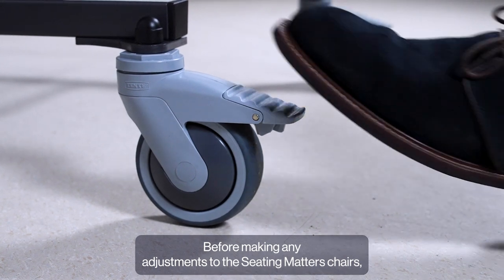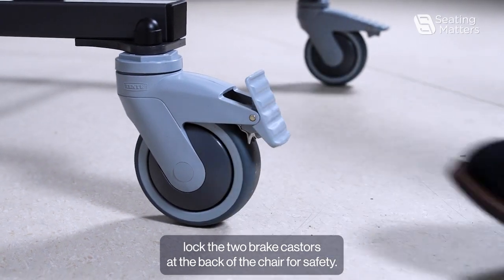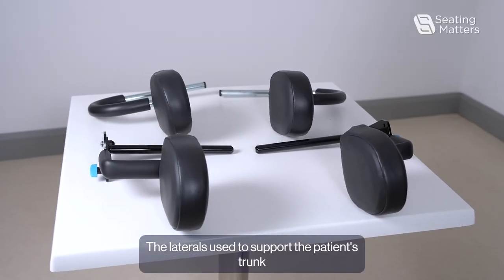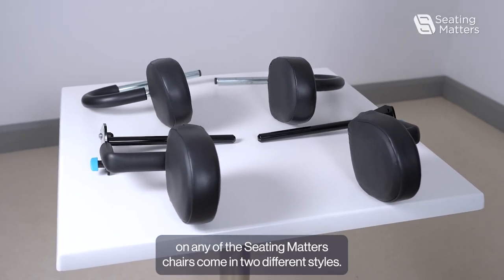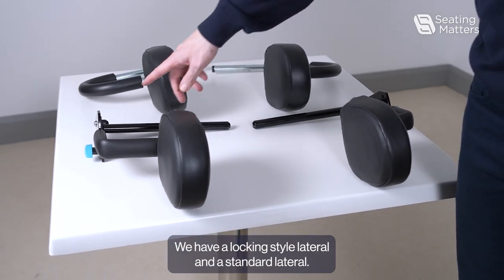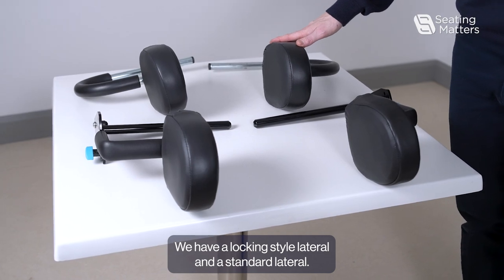Before making any adjustments to the Seating Matters Chairs, lock the two brake casters at the back of the chair for safety. The laterals used to support the patient's trunk on any of the Seating Matters Chairs come in two different styles: a locking style lateral and a standard lateral.